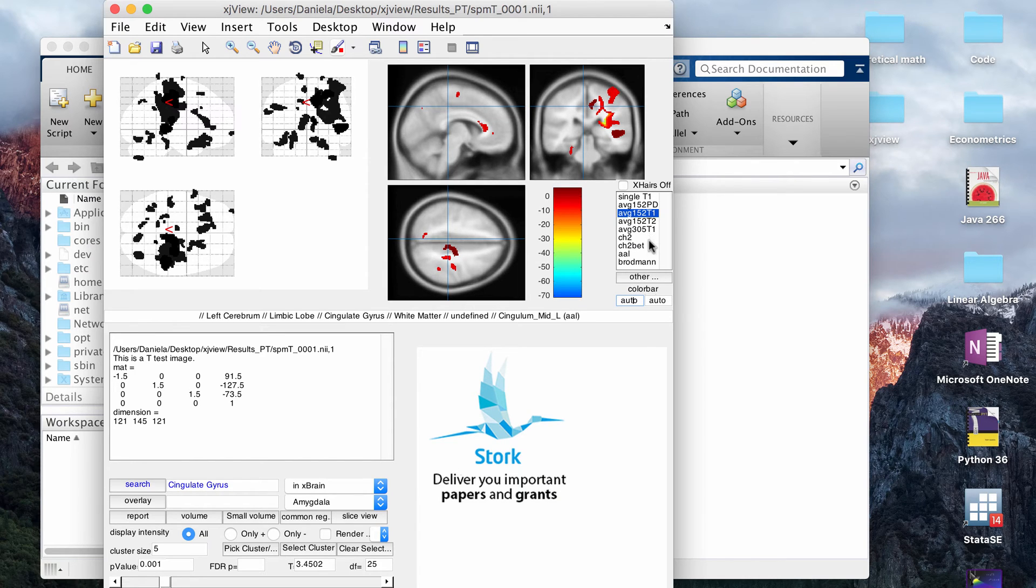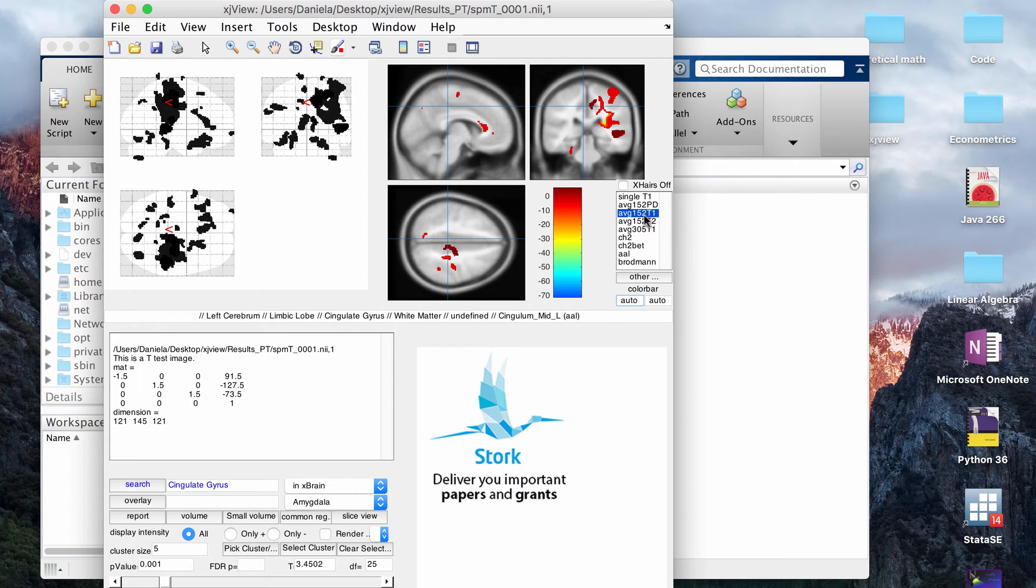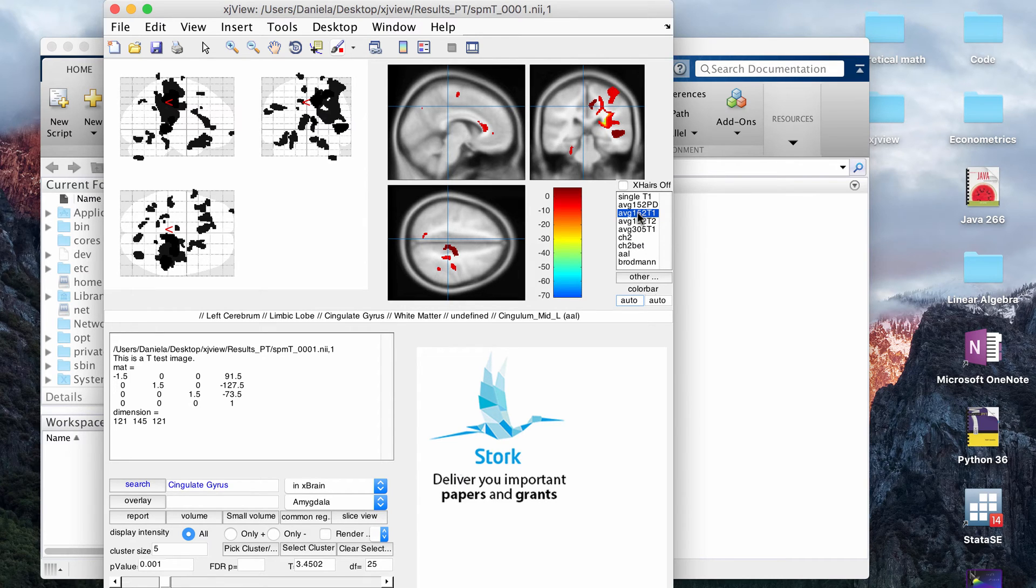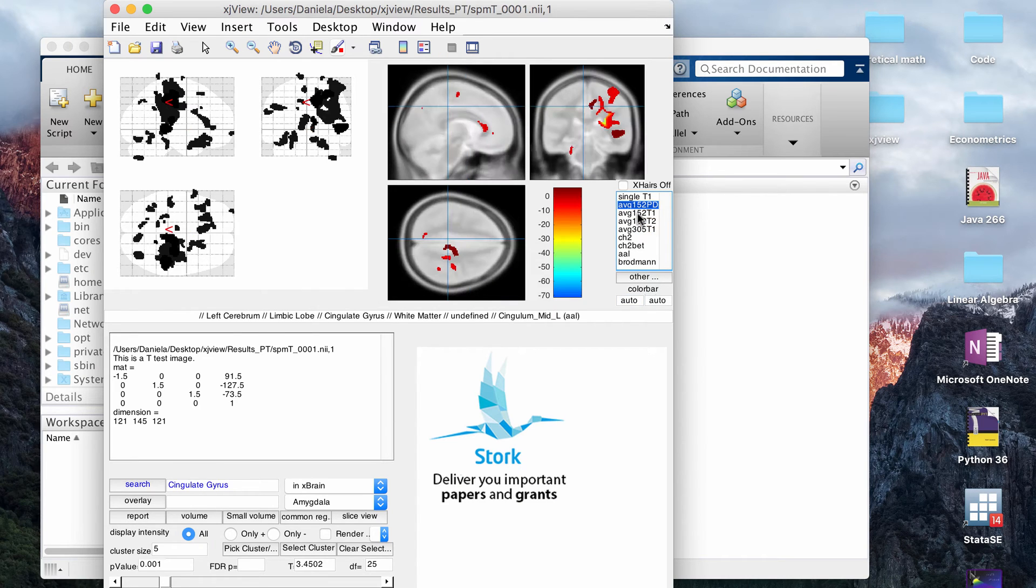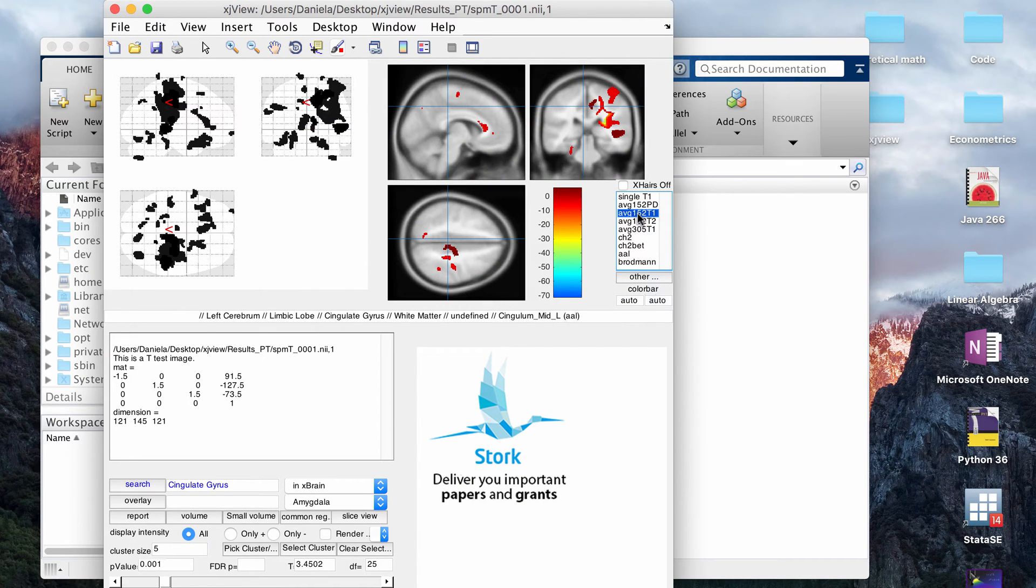Now I think these files here are the options for the underlay, I guess you could call it. This is showing you an average T1 provided by SPM and it's the gray brain essentially that's under the TMAP that's the overlay. I usually for VBM just leave it as the default. You have a couple options provided by SPM and this, I think, is the SPM forward slash canonical folder, if I'm not mistaken.